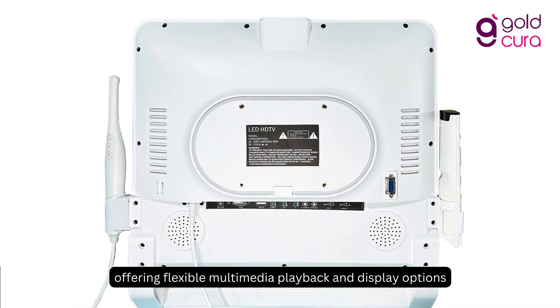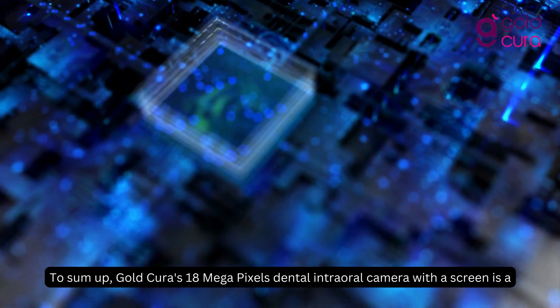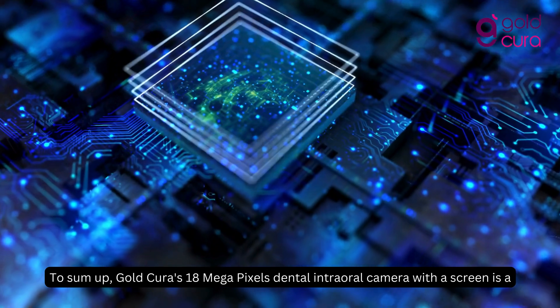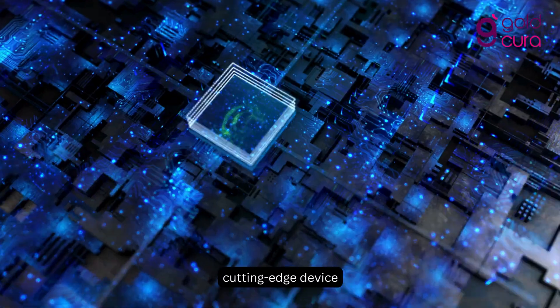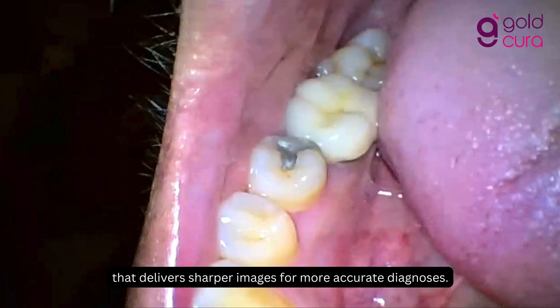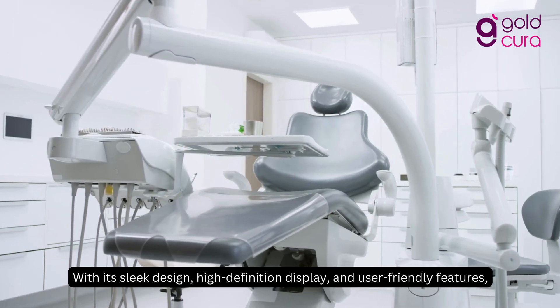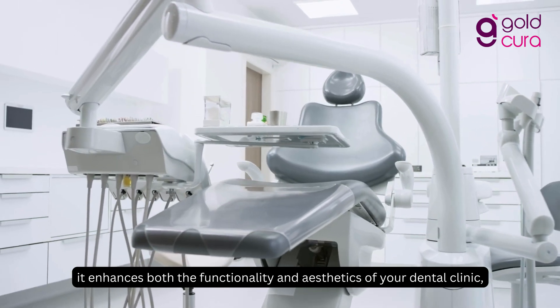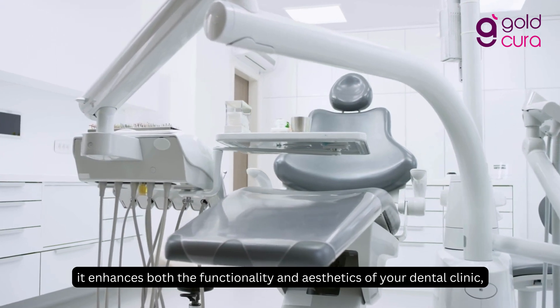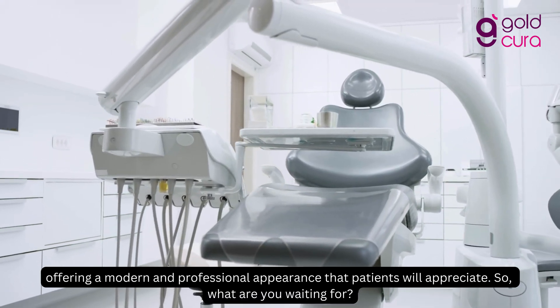To sum up, Goldcura's 18-megapixel dental intraoral camera with a screen is a cutting-edge device that delivers sharper images for more accurate diagnoses. With its sleek design, high-definition display, and user-friendly features, it enhances both the functionality and aesthetics of your dental clinic, offering a modern and professional appearance that patients will appreciate.